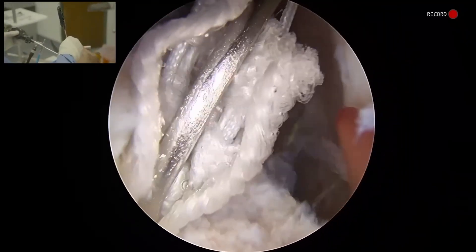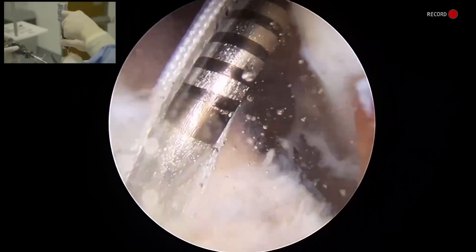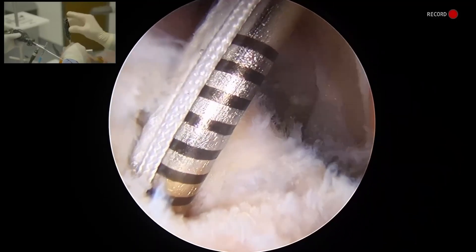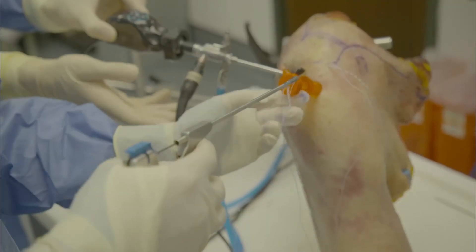Once we have positioned our anchor, go ahead and mallet that. We'll bring it down to this central portion, about midway here, and then once we have it loaded, we'll just pull it straight back. We're going to pass this through our lateral row here.